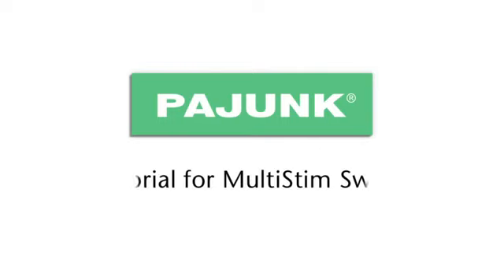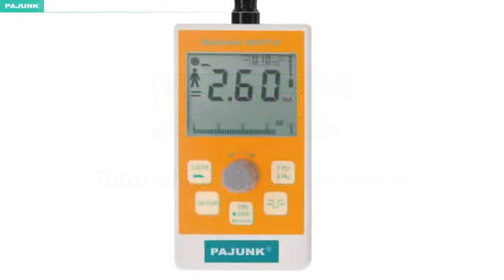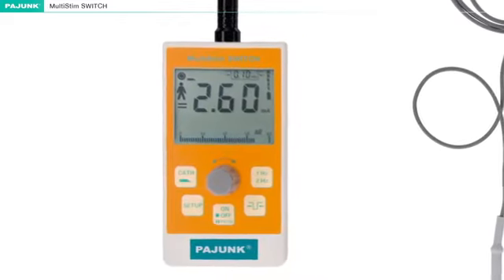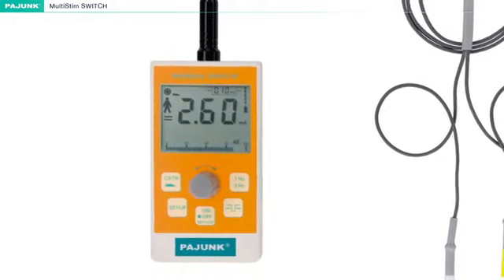Tutorial for MultiStim switch. The Pajunk MultiStim switch can be used for the location of both peripheral nerves and for epidural stimulation.